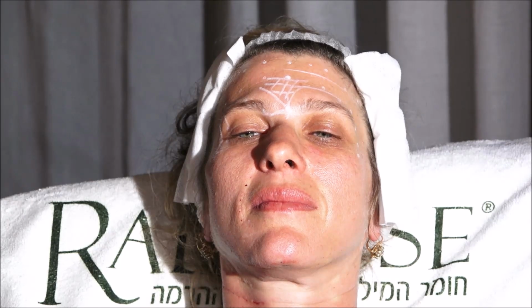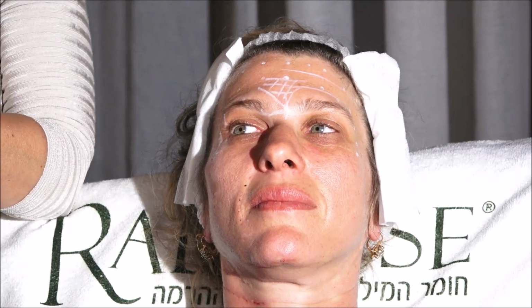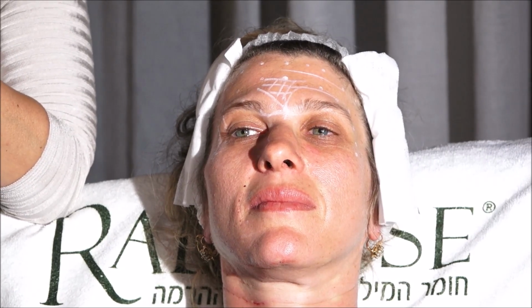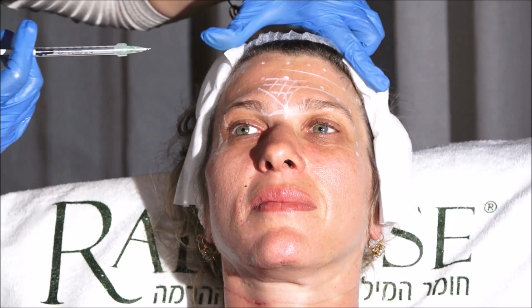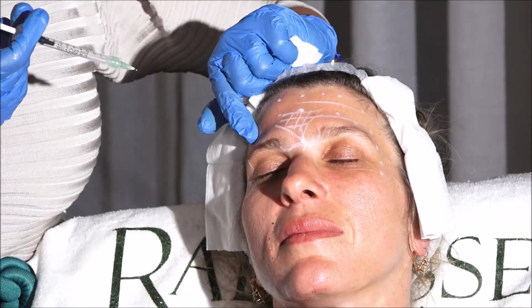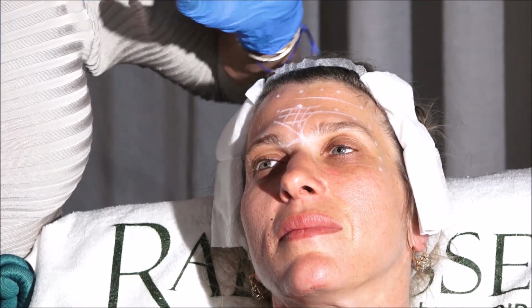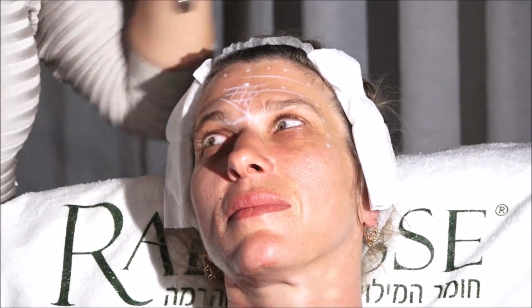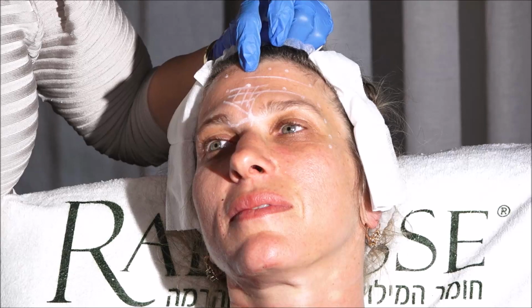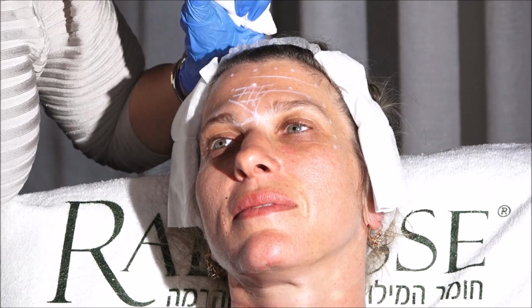So this is 100 units diluted to 2. Every trace in this syringe is 1 unit in this dilution because it's a 50 trace syringe. It's a Luer lock. So I'm going to start injecting. Remember that deeper here, moderately deep, superficial. Not because I'm intradermal, because the muscle is more or less at 2 millimeter difference. I have a 4 millimeter needle. So if I have to go 3, I have to put 2/3 in. If I have to go 2.5, I put half in. And here, 1/3 in. Okay?